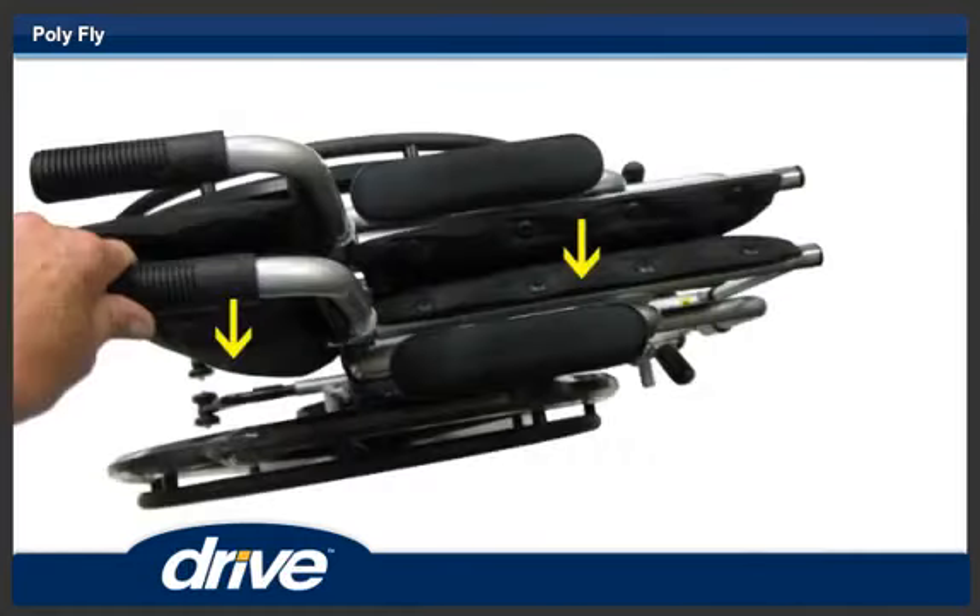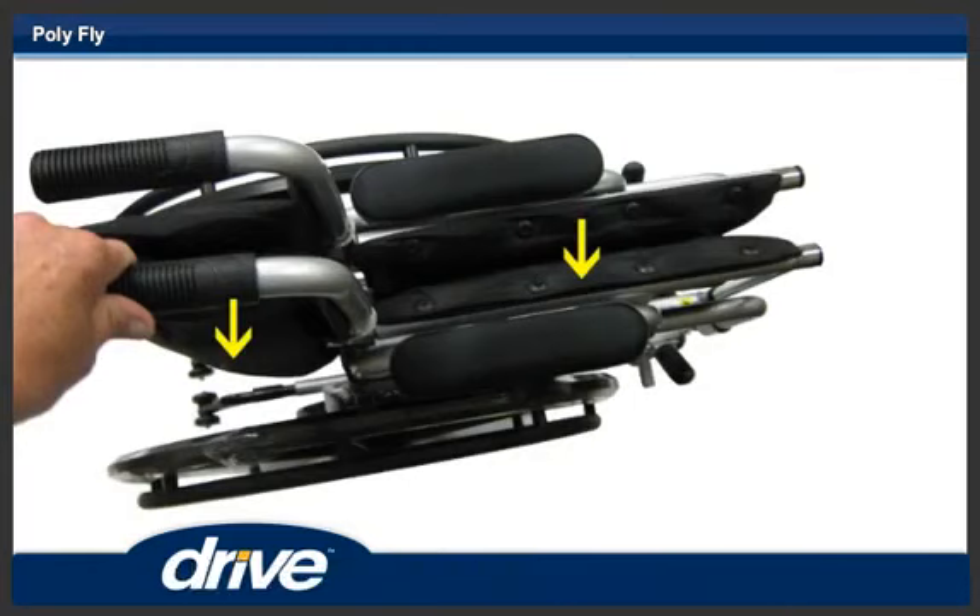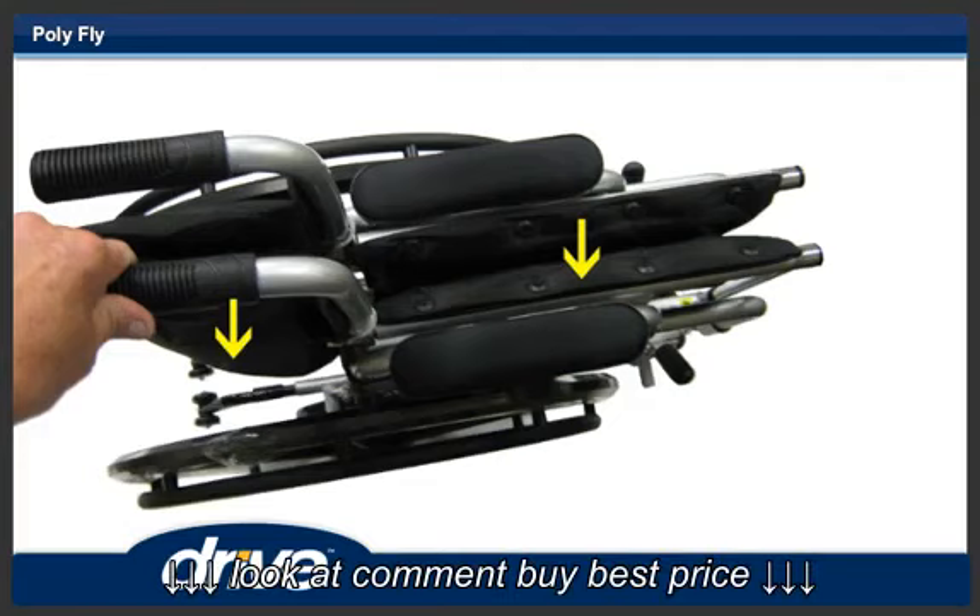Step 3. To unfold the chair, grasp one of the handles and tilt the chair slightly. Push down on the top of the cross brace on the side of the handle you are holding.